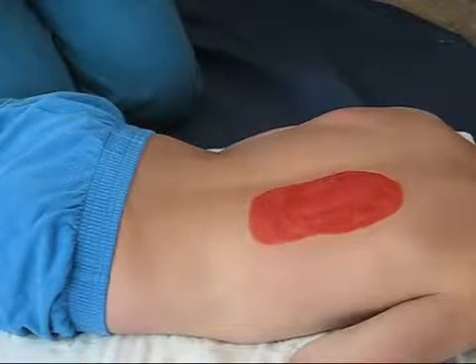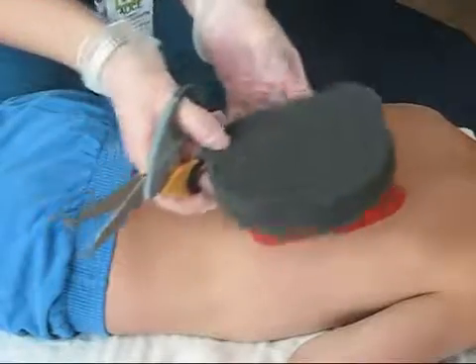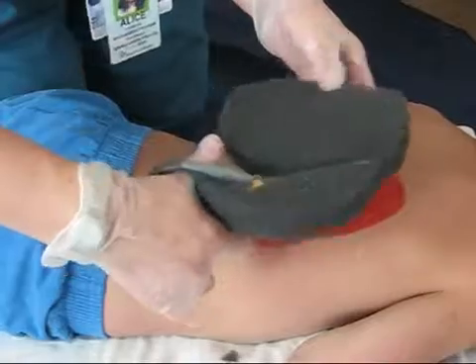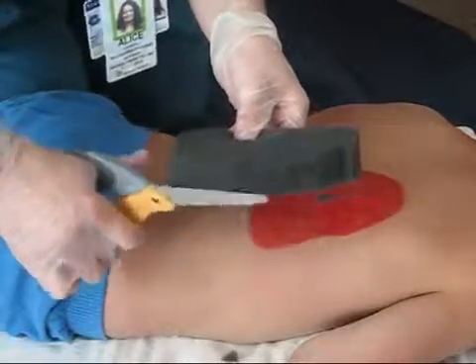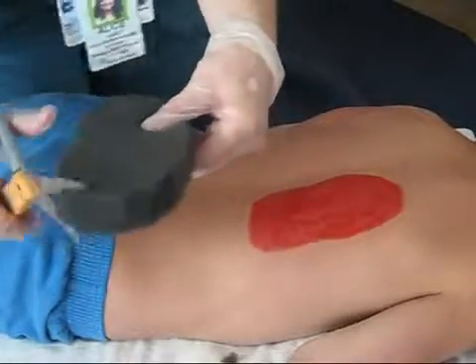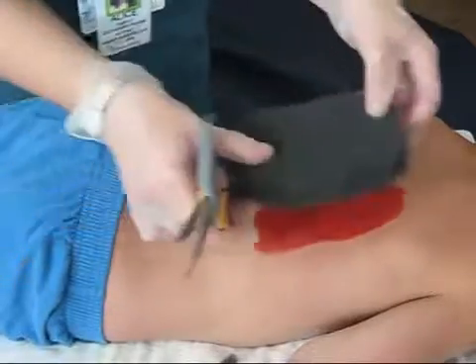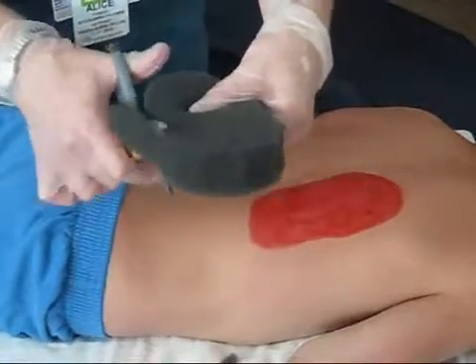Next, you want to take your sponge and cut as much as you need off, and try to make it match the size of the wound exactly. Try not to get any small pieces from the sponge into the wound bed, as that will grow into the wound as the wound heals. You want to make sure it doesn't overlap the wound. You might need to cut and trim, trying to get it as exact as possible.